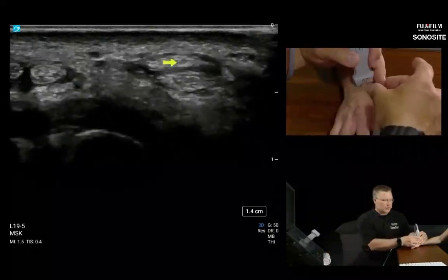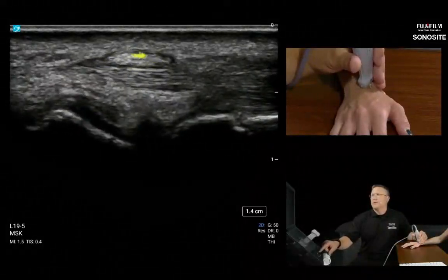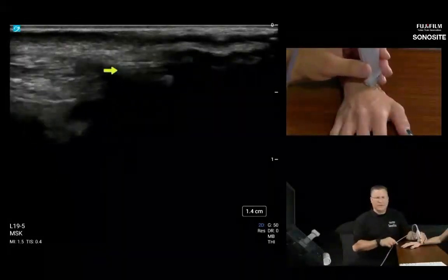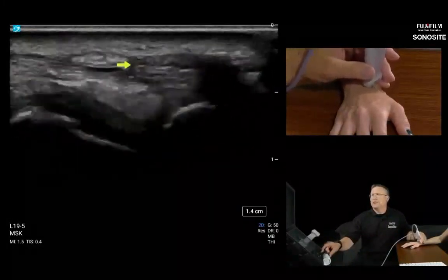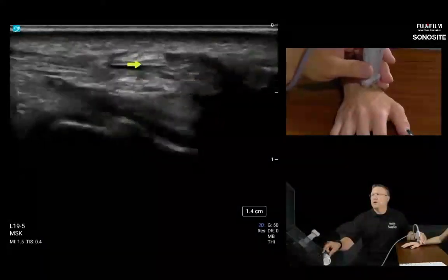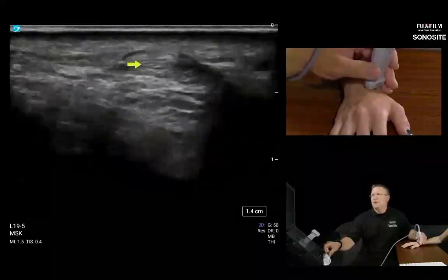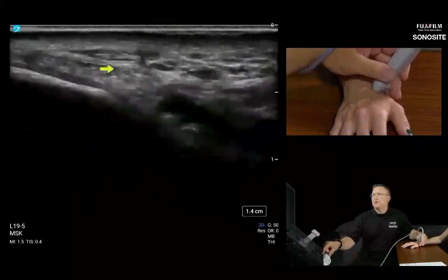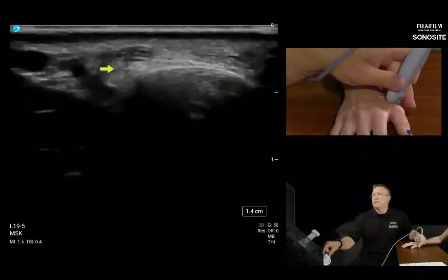I'm going to turn the probe and aim it down the thumb, and I get a nice oval superficially here. And just like the median nerve on the volar wrist, when we're scanning a small structure that's an oval, what we're going to do is center it in the screen right here, and we're going to take small segments at a time. So I'm just going to trace this tendon proximally distally. When I feel comfortable with its trajectory, I'm going to go a little more distal. I'm going to readjust my angle, and I'm going to follow this oval again, proximally distally. And you're just going to keep evaluating that tendon until you've left the area of concern.